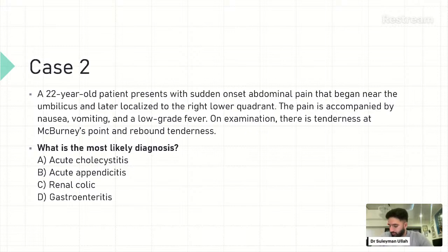So, what is the diagnosis for this? So, I think someone has a question. Okay, that's a very good question. So the question is, is X-ray or CT the first line imaging modality when we have this patient in clinical practice?